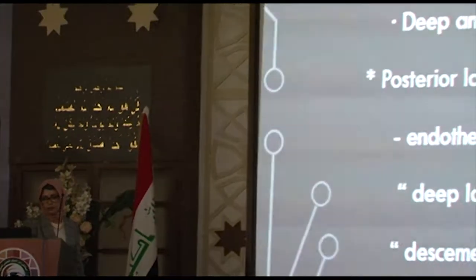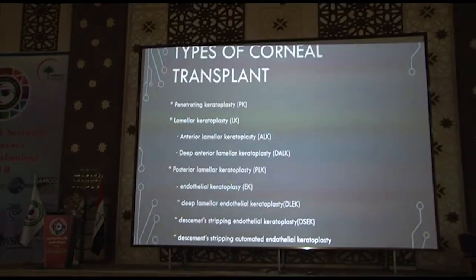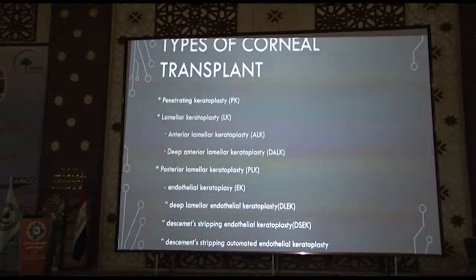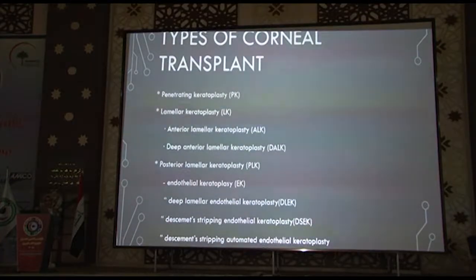Posterior lamellar keratoplasty, endothelial keratoplasty. Deep lamellar endothelial keratoplasty, which is DLEK, Descemet stripping endothelial keratoplasty, DSEK, Descemet stripping automated endothelial keratoplasty. Here the difference is the graft is prepared with a keratome. And also Descemet membrane endothelial keratoplasty, which is called DMEK.